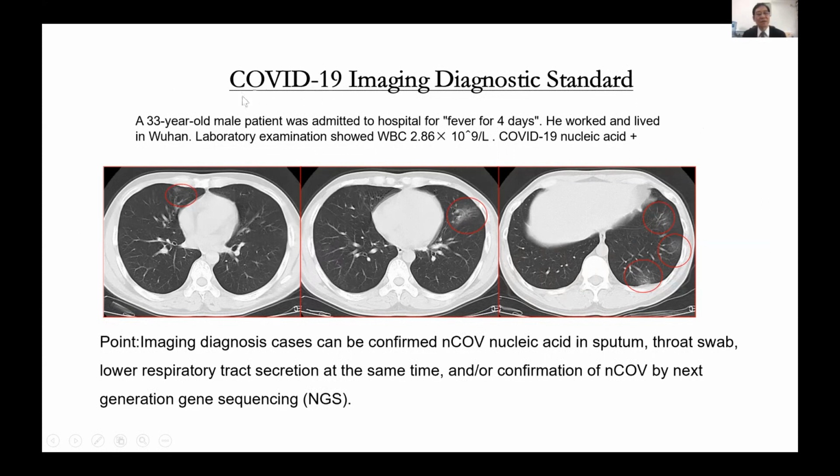Each case, COVID-19 image diagnostic standard, follow case. A 33-year-old male patient was admitted to the hospital with fever for 4 days. He worked and lived in Wuhan. Laboratory examination is shown here: COVID-19 nucleic acid positive. The point is that imaging diagnosis cases can be confirmed.